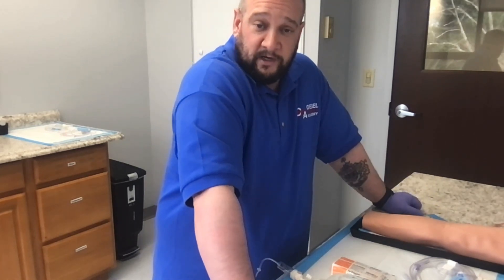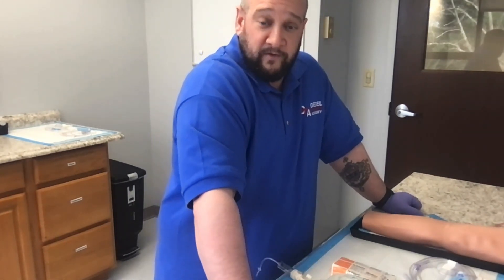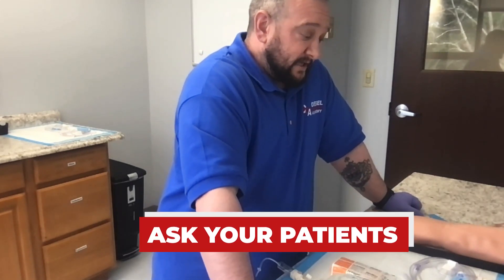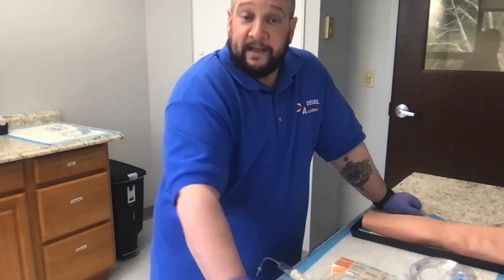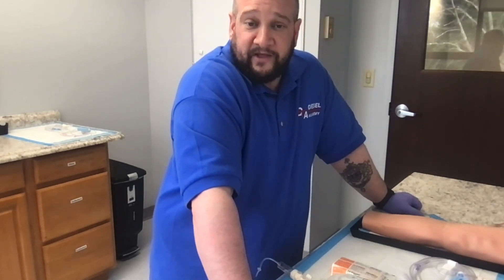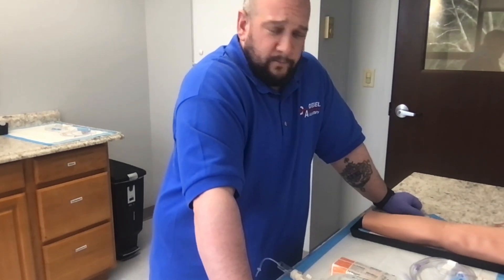Remember we can't start IVs on the side where a patient has a fistula or graft for dialysis, and we shouldn't go on the side of a patient who has had a mastectomy with lymph node removal. Ask your patients: 'Is it okay if I start an IV on this side? Is there any reason I shouldn't use this arm?' Ideally we want to do this in one attempt — we don't want to keep poking our patients — so gathering this information upfront is essential.